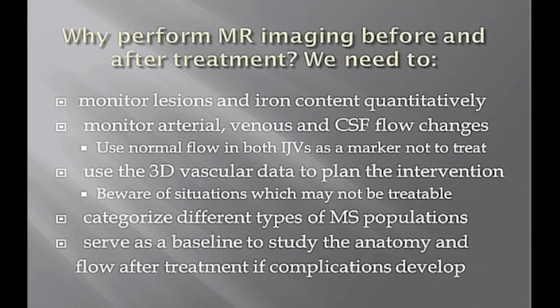And then there are other cases that are so complicated where you have the internal jugular vein merging into the external jugular vein. Should you be doing anything? I think you need, as interventionalists, to be planning this ahead of time before you go in to do this. Do you have the tools to do it? You clearly do. You could use CT. You can use MR. CT won't give you flow, however.